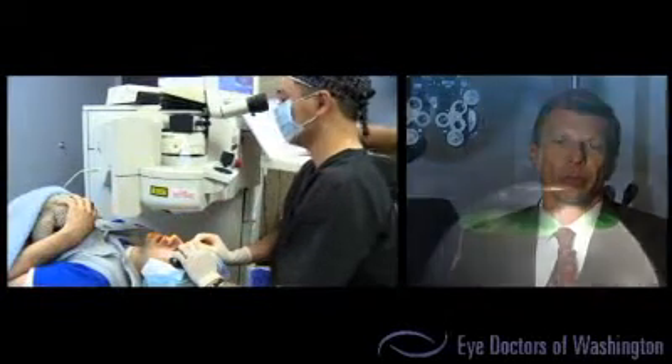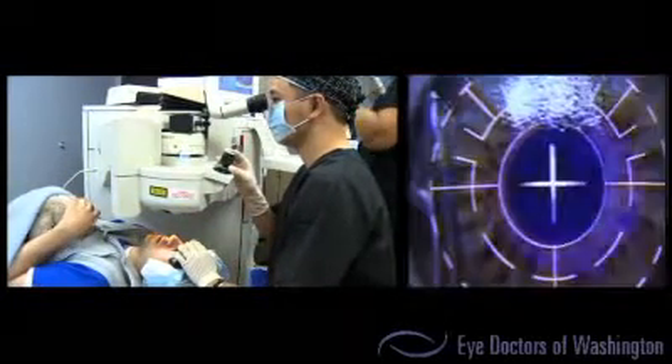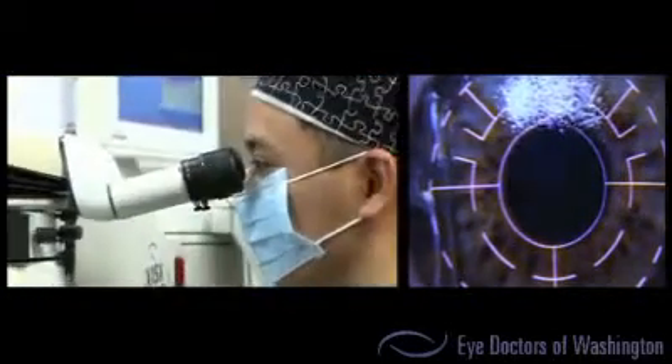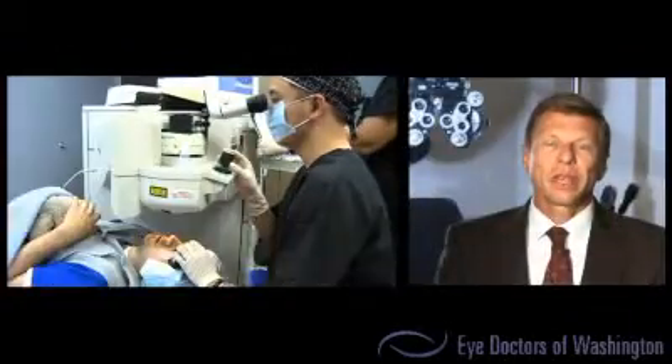During the next part of the procedure, Sammy's flap is lifted, and then we use the excimer laser to reshape his cornea. Now that the custom excimer laser treatment has been completed, Sammy's flap has been repositioned. It was too easy. It was like 35 minutes — no joke. It takes me longer to get Chinese food than it did to get my LASIK surgery.